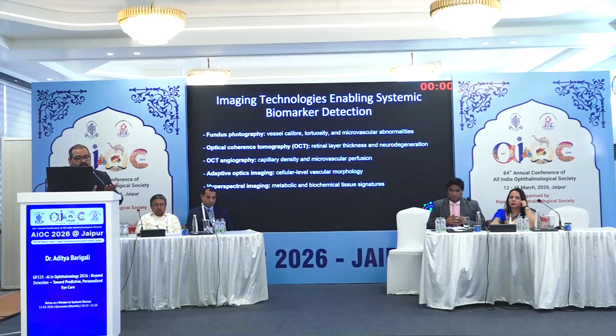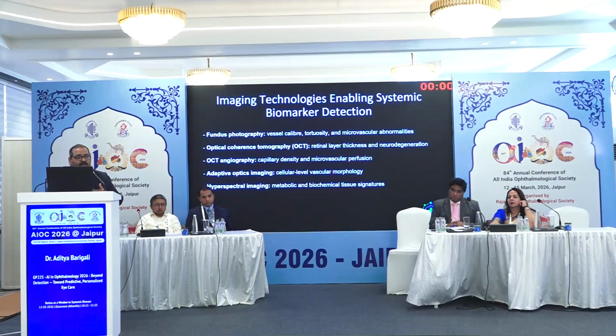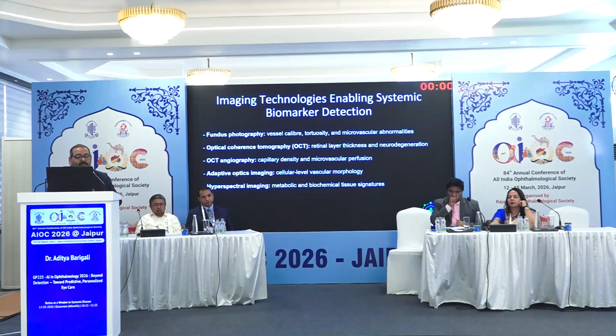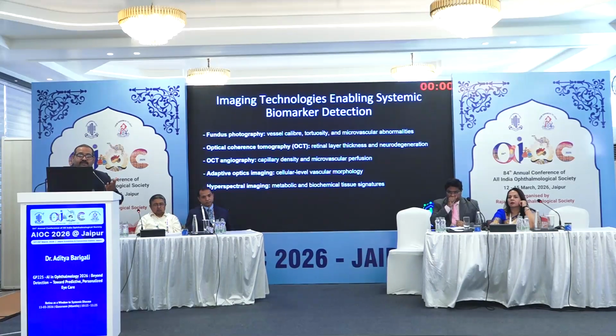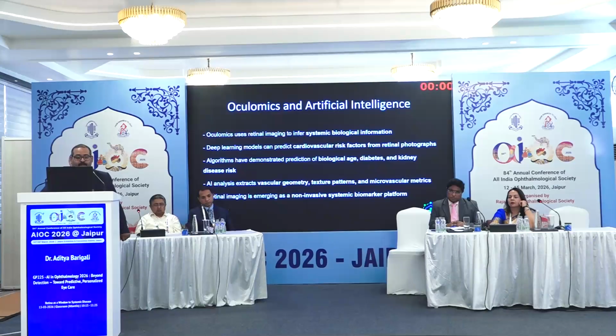The technology on the horizon is hyperspectral imaging. Basically, one image taken across wide spectra of light shows metabolic as well as biochemical tissue signatures. Commonly we see this as fundus fluorescence, the autofluorescence images.